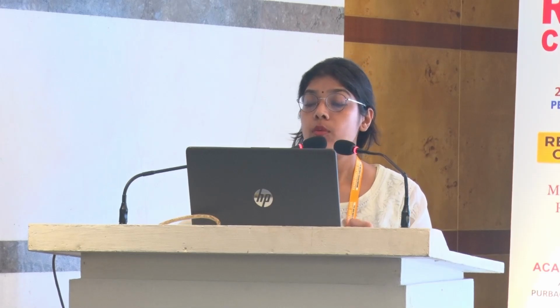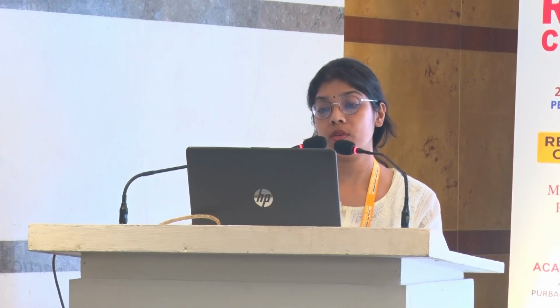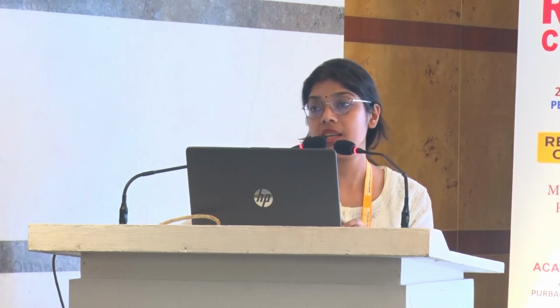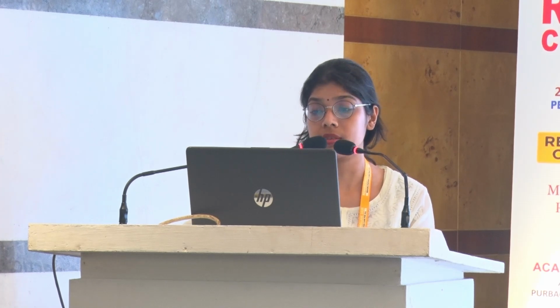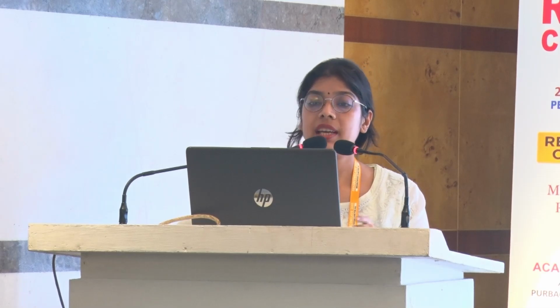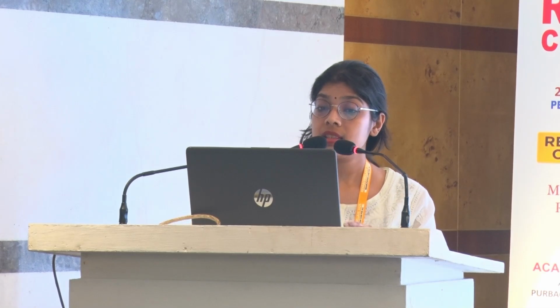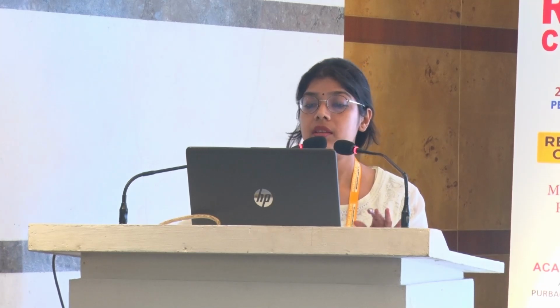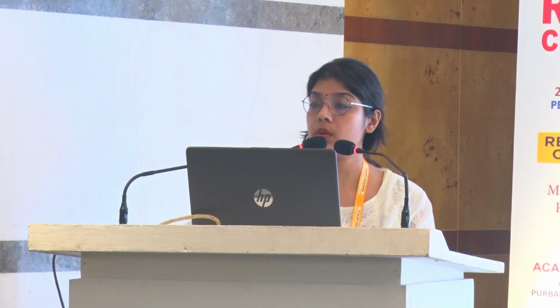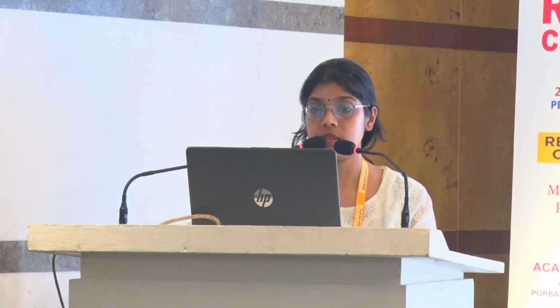And for monoarthritis, where we're suspecting TB or any other infection, we can do synovial biopsies and muscle biopsies in case of myositis, especially focal myositis. So the structures evaluated are the synovial membrane. We check whether there's an effusion or not, the tendon surrounding the joint, regional musculoskeletal pathologies like de Quervain's and tennis elbow, and bone erosions which suggest chronicity.